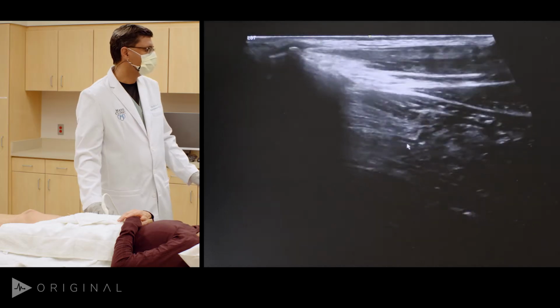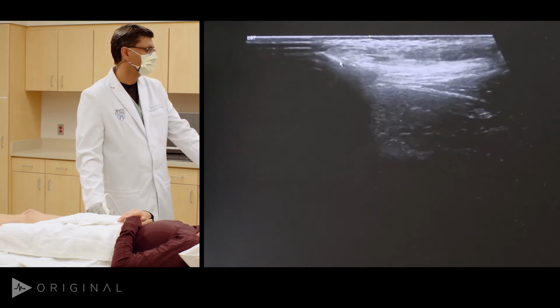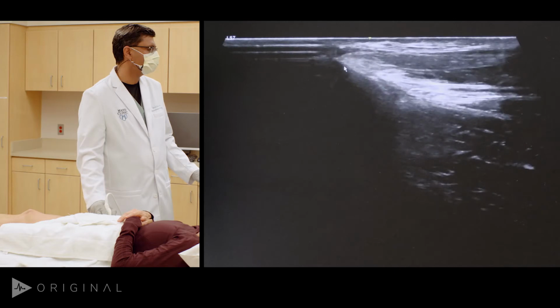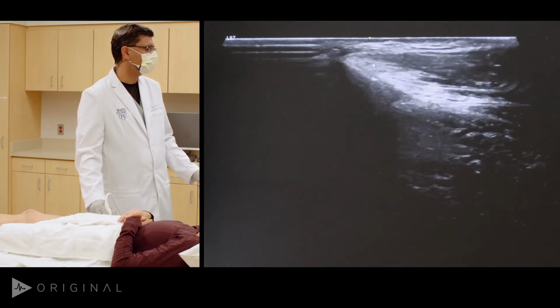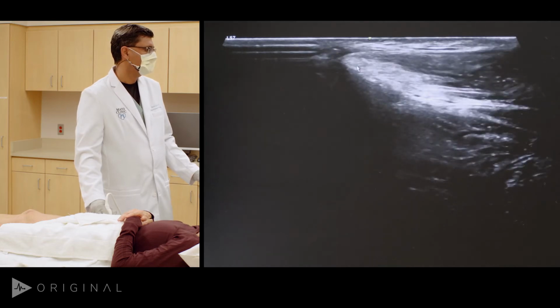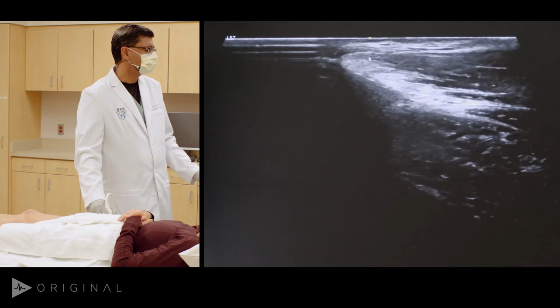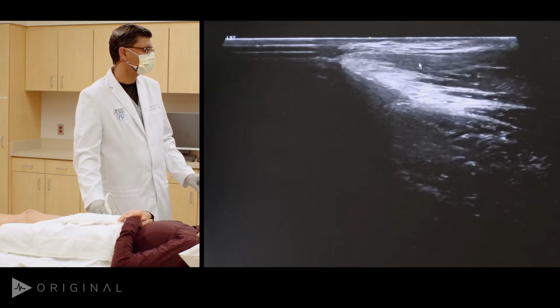Now you can see on the equipment that is the bone, the anterior superior iliac spine right there. And right there, that is the sartorius tendon muscle unit. If there is any hypoechogenicity in this area, that can sometimes be a cause for chronic pain, and then you have the sartorius muscle as you go distally.